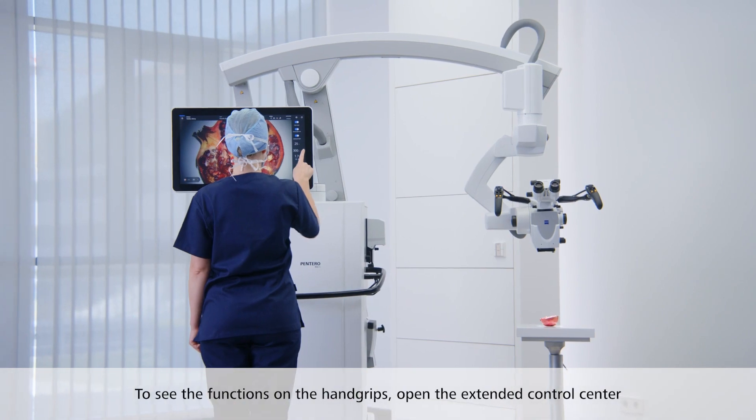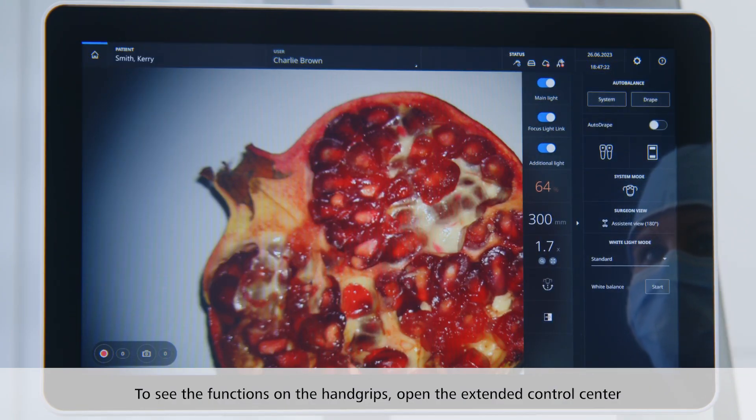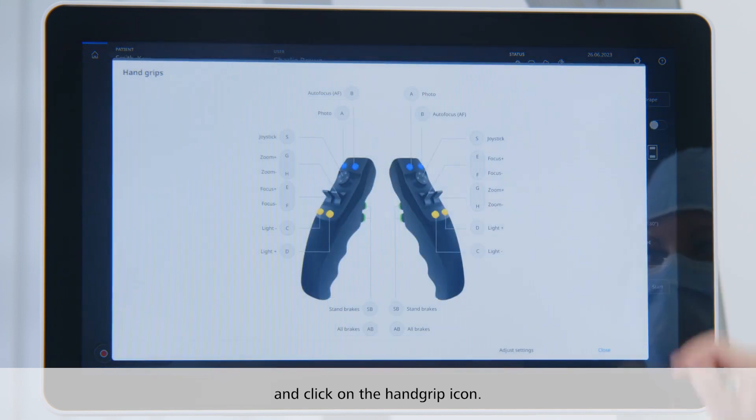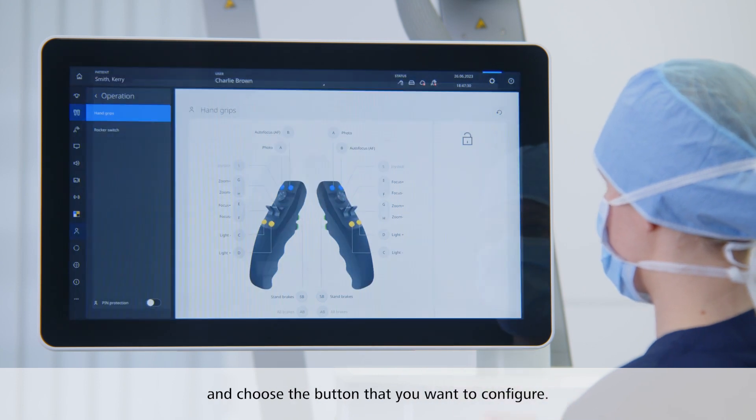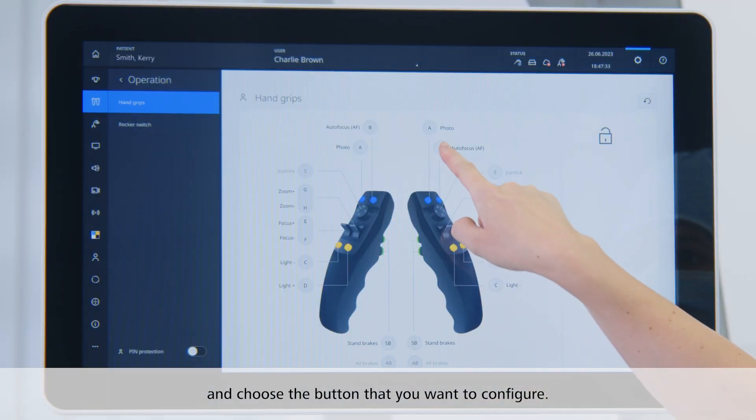To see the current functions on the hand grips, open the extended control center and click on the hand grip icon. If you want to change the functions, click on adjust settings and choose the button that you want to configure.